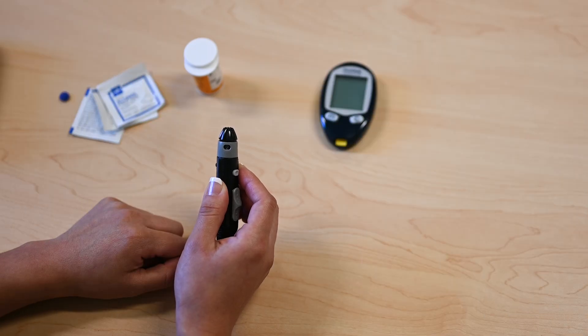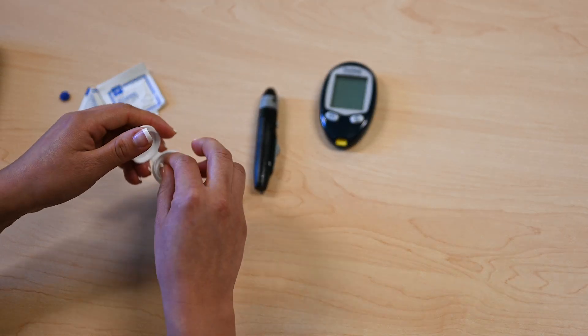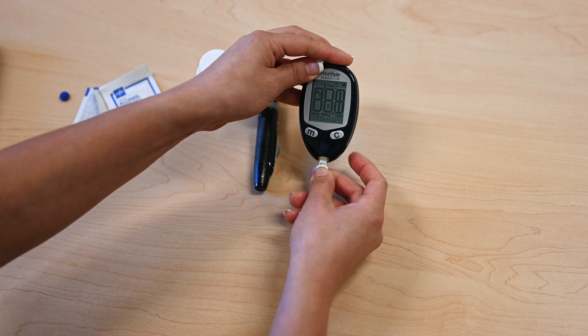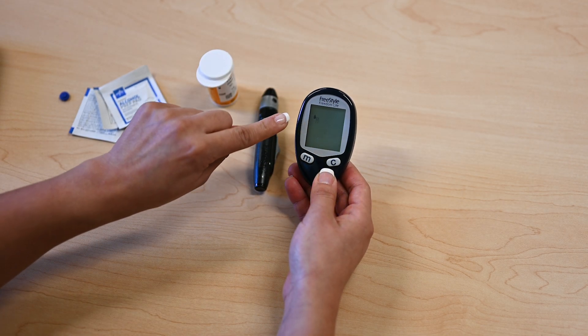Insert the test strip into the meter. With the FreeStyle test strips, the butterfly side goes up. Inserting the test strip wakes the meter up. The meter will then tell you that it wants a drop of blood, as indicated with the flashing drop icon.